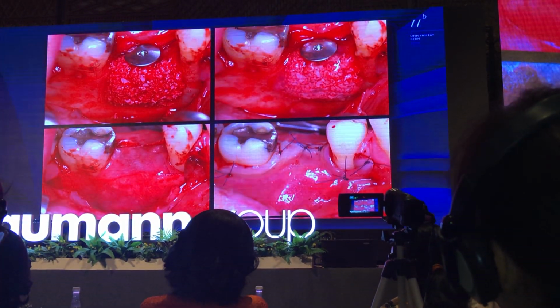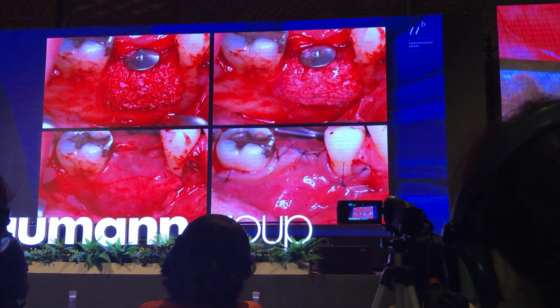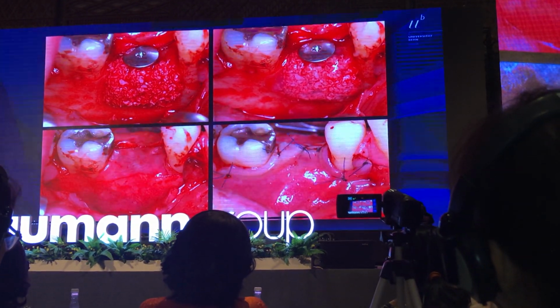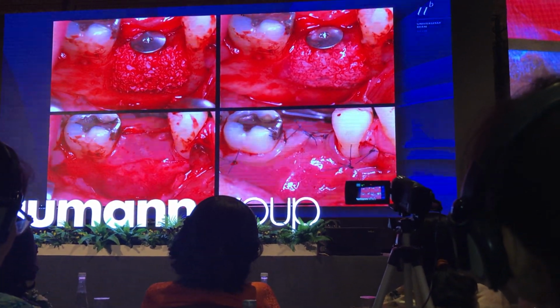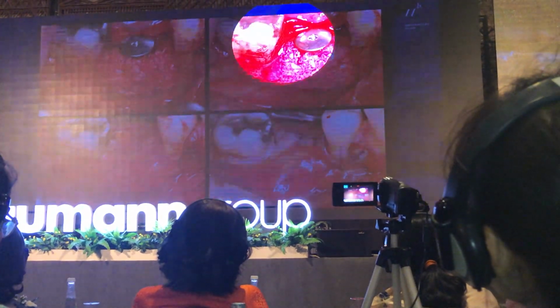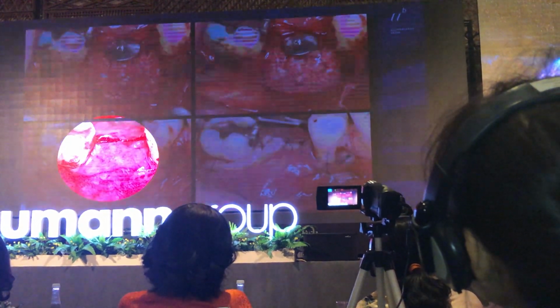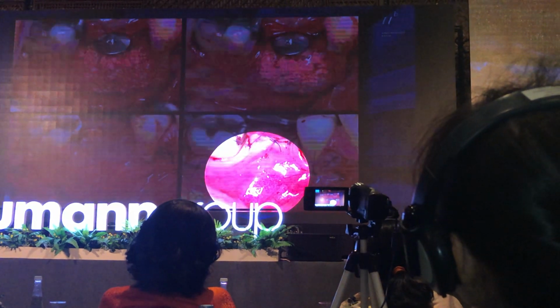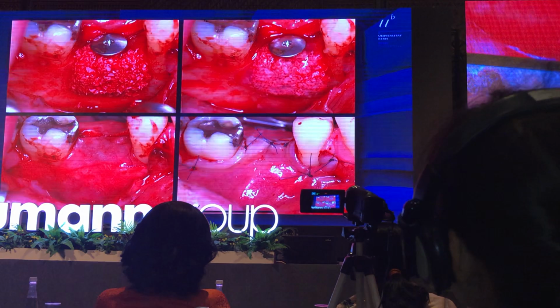Okay, then comes a second layer, a low substitution filler, and fibrin sealant on top. As you can see, it's the shiny, whitish color. And then the membrane on top. Double layer technique. And the closure on top. So we have everything covered up.